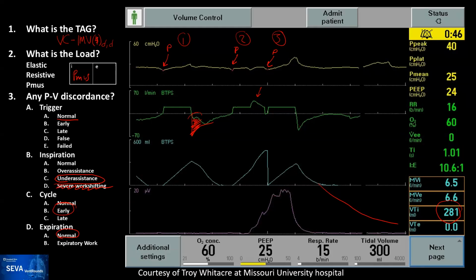This is an arrhythmia of the respiratory muscle activation, in which the chest wall activates first and then the diaphragm, when usually there's a progression of the signal because it comes from the bulbar region, right? So it caught my attention, definitely.